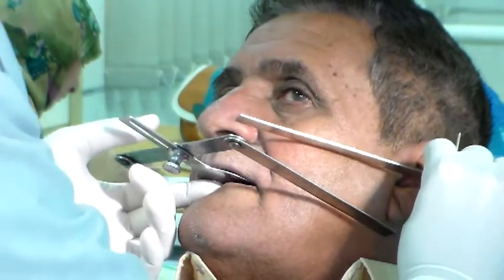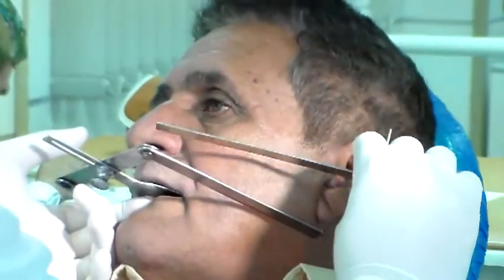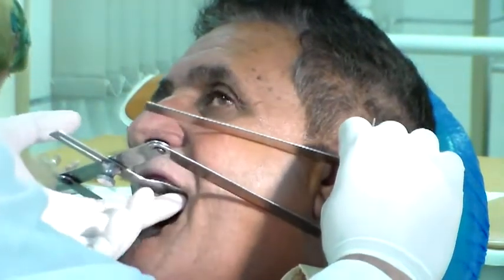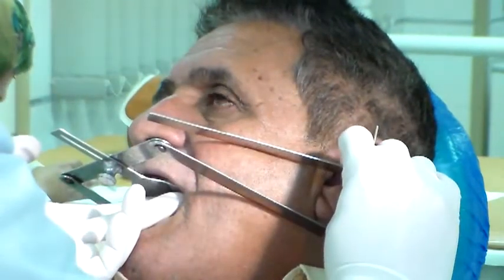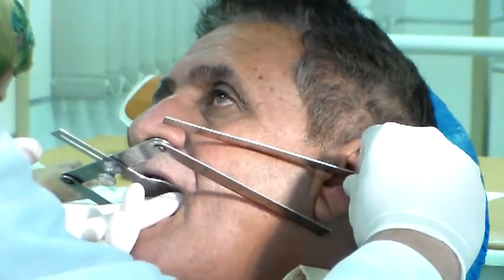Place the ruler from the ala to the tragus like this. Make sure it is supported so it doesn't fall off. When I place it like this, I see that there is more space in the posterior here than there is in the anterior.